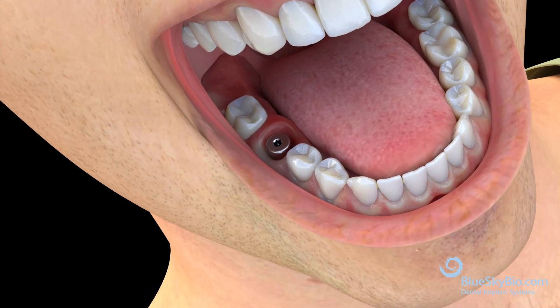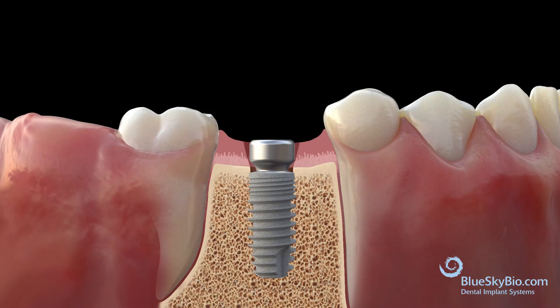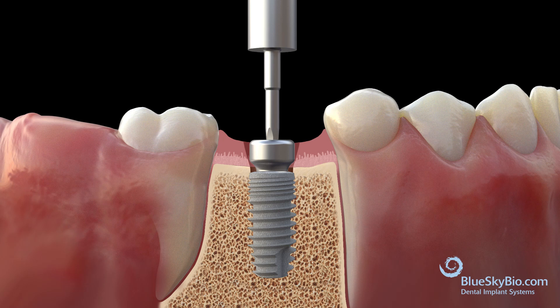A Biomax implant and healing abutment are placed in the lower first molar region. The implant is placed below the edge of the bone crest, while the healing abutment is flush with the top edge of the gum line. Use the 0.048 hex driver to remove the healing abutment.